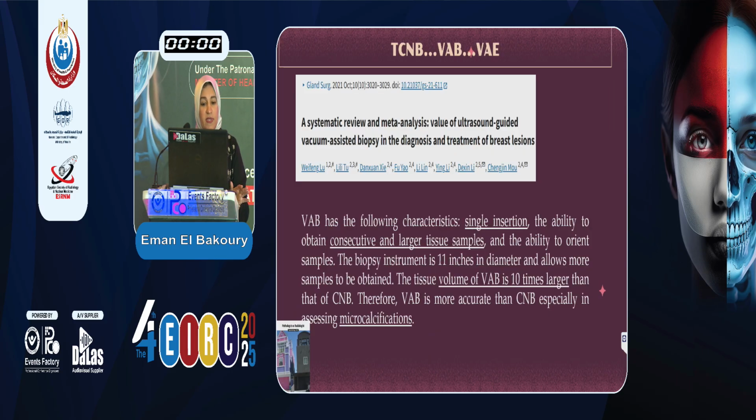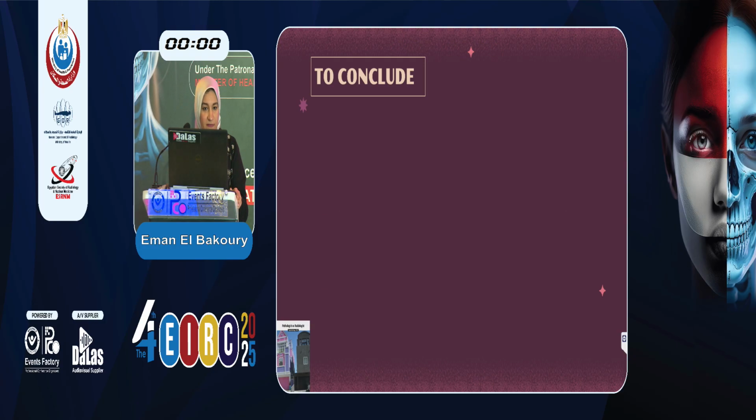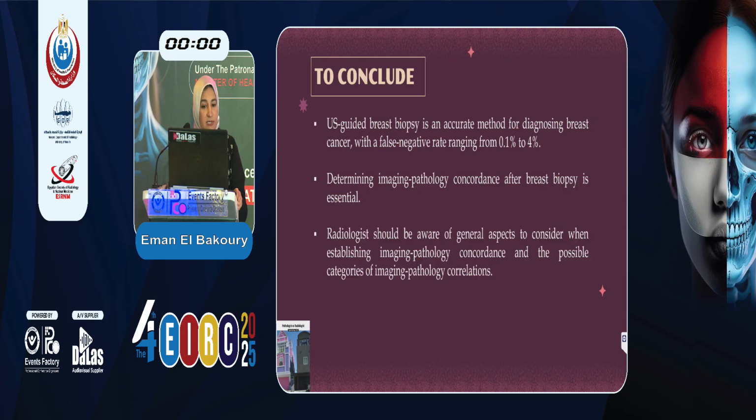So the vacuum, as said before, is characterized by a single insertion and consecutive larger cores, and it's very sensitive for microcalcification. However, it's expensive and less available. So to conclude, the ultrasound breast biopsy is an accurate method for diagnosing breast cancer with a false negative rate of up to 4%. Determining the imaging-pathological concordance after biopsy is essential.